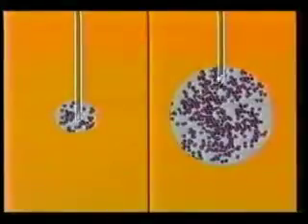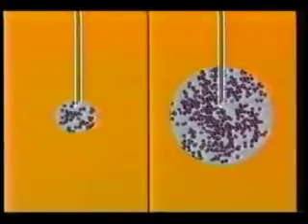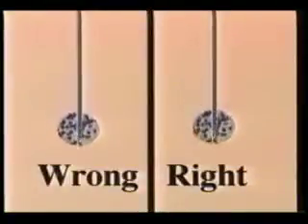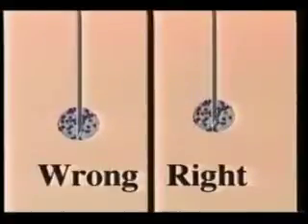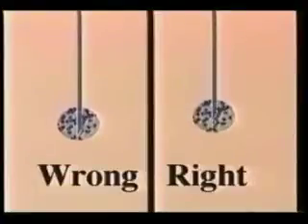The length of the needle excursions should be tailored to the size of the lesion. In other words, when sampling a small target, make short excursions in order to stay inside the target. In a larger lesion, longer excursions are usually more effective. If the lesion is suspended in pliable tissue, such as lung, the excursions may need to be longer in order to compensate for the target moving up and down with the needle.